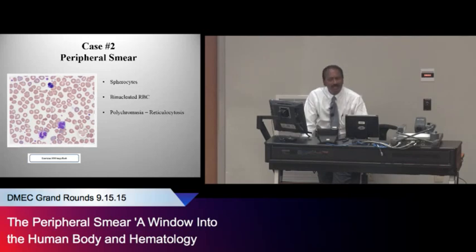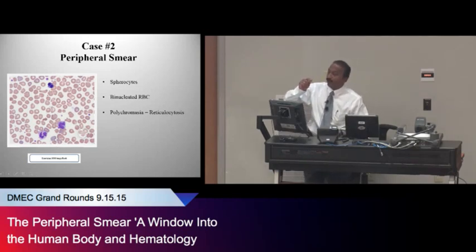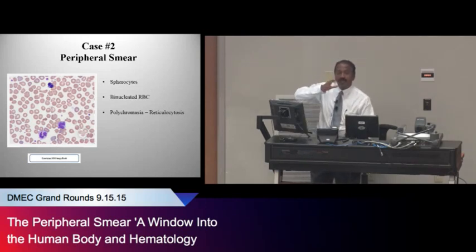And on the CBC, you may not see a whole lot of stuff other than this stuff. That's polychromasia, that's a reticulocyte count. Those cells are a little larger and they have a slightly different color. And if you actually play with your microscope and you change your fine tuning on it, you'll actually see the violet color change back and forth, which your normal red blood cell will not do. And that tells you an idea, hey, that's a retic. And basically that's all you're seeing in this peripheral smear. In autoimmune hemolysis, you won't see a whole lot of other stuff.